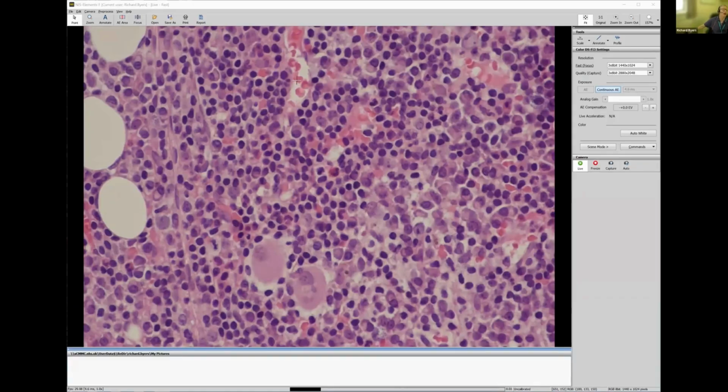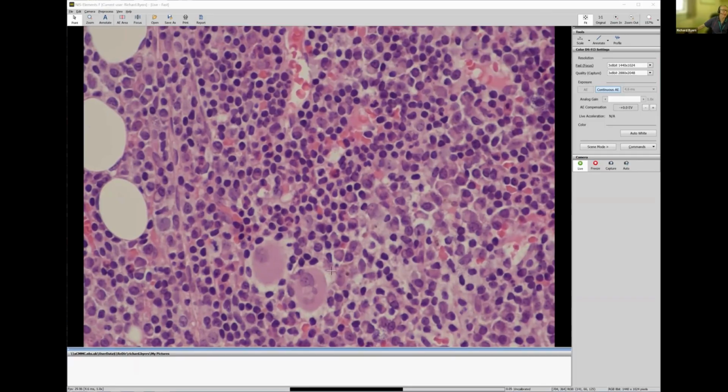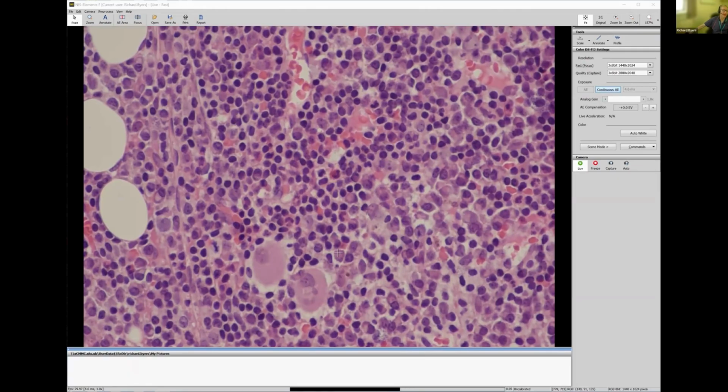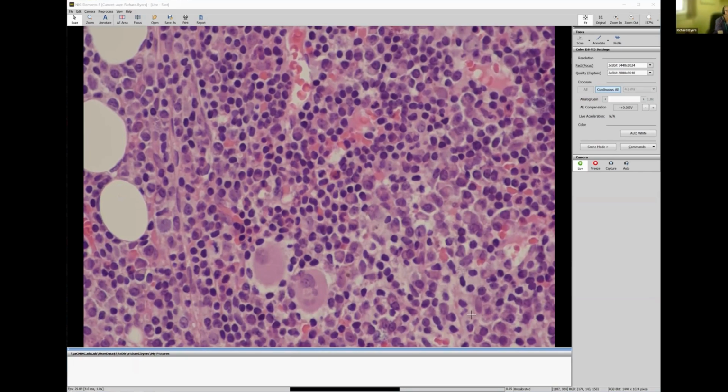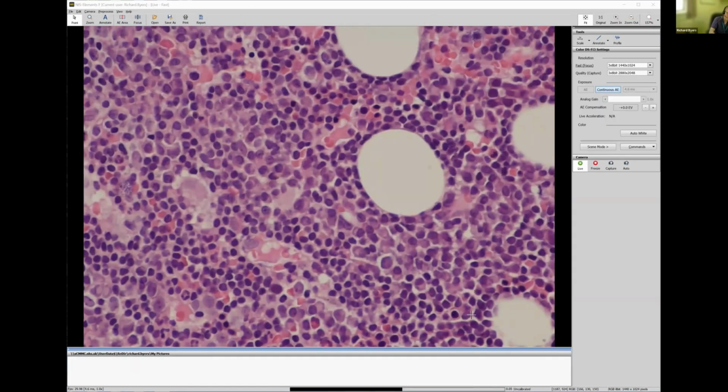shows that the infiltrate looks like lots of small lymphoid cells, very dark nuclei. No real small space around. This one here's got a small space. That's probably erythroid. So we've got lots of small, slightly irregular lymphoid cells, and also plasma cells there, this area through here, these ones here, some more down here. So it was sent for query workup for myeloma.